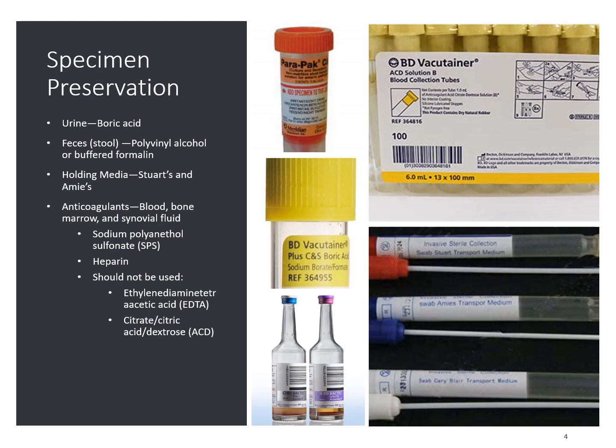These tubes are for HLA typing in blood bank or different types of DNA and genetic studies. So making sure that you use the proper tube is very important, and if you're ever in question, you always need to pull the specimen label back with the patient's name on it, just to make sure that the label on that tube is adequate for that particular specimen or culture that you are performing.